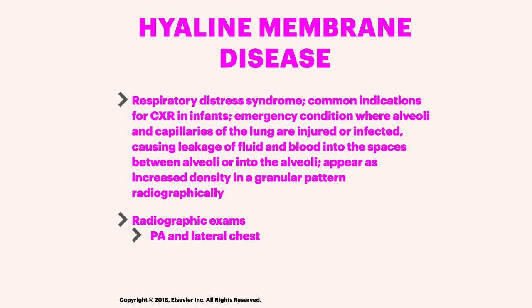Hyaline membrane disease, respiratory distress syndrome, a common indication for chest x-ray in infants. An emergency condition where alveoli and capillaries of the lungs are injured or infected, causing leakage of fluid and blood into the spaces between the alveoli or into the alveoli. Appears as increased density in a granular pattern radiographically. PA and lateral chest are your radiographic exams.